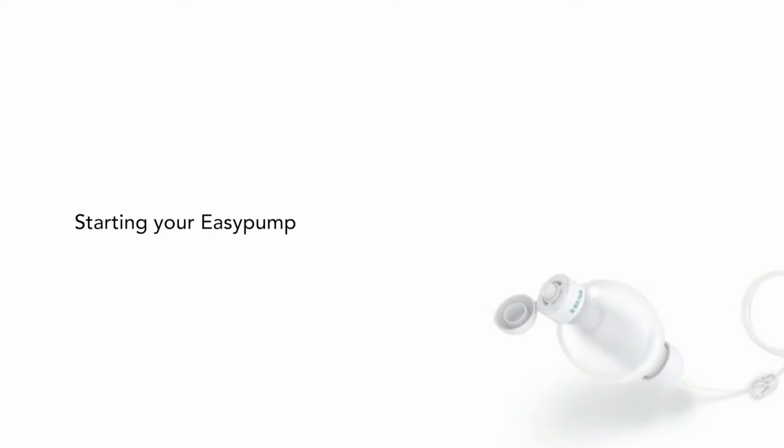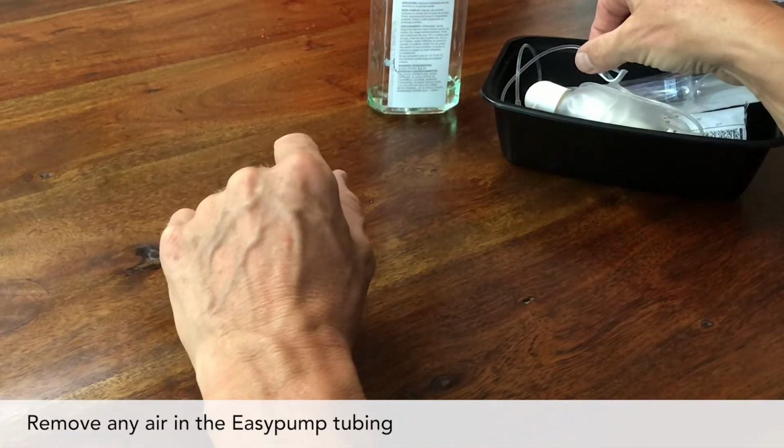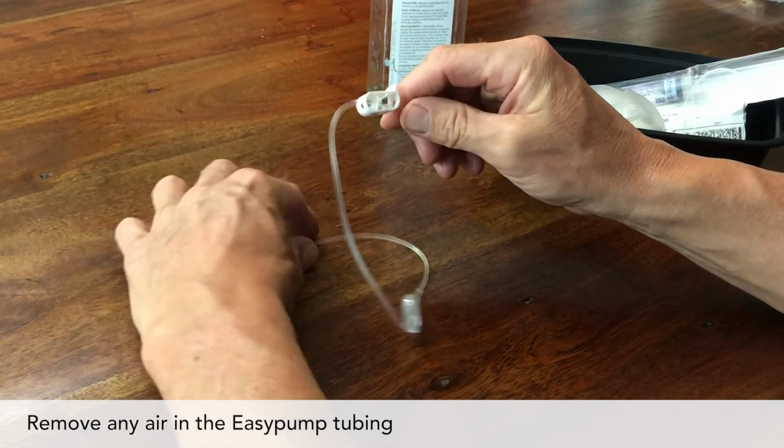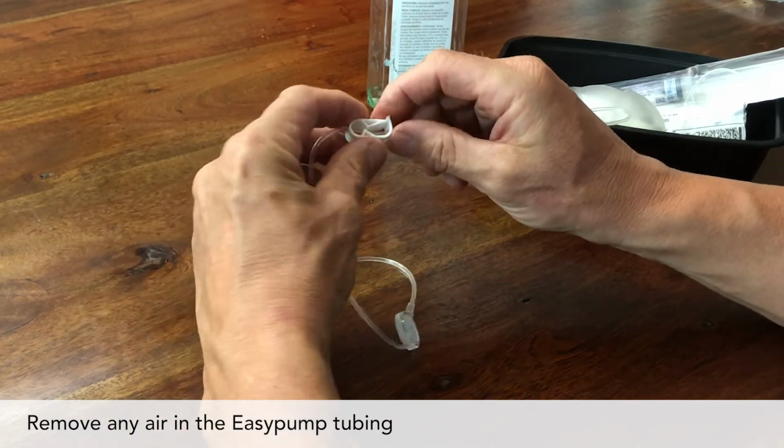It is important to give the medicine close to the time you were told by your healthcare provider. Your medicine will be more effective at treating your infection if you take the medicine at the planned times. Look at the pump tubing. The pharmacy will have filled the tubing with medicine. You should check though to make sure that there's no air in the tubing.